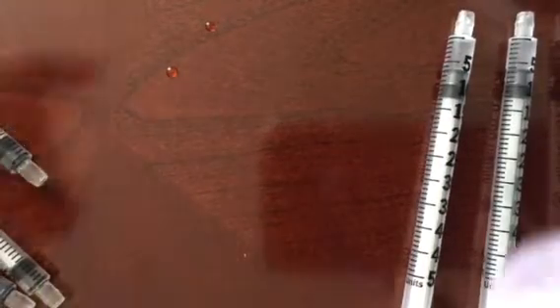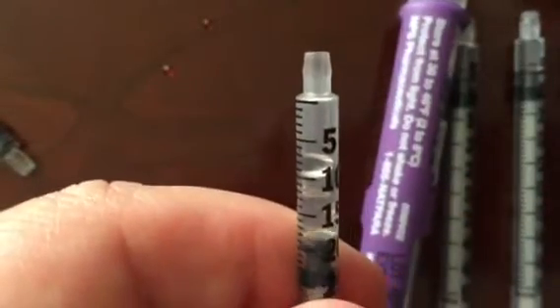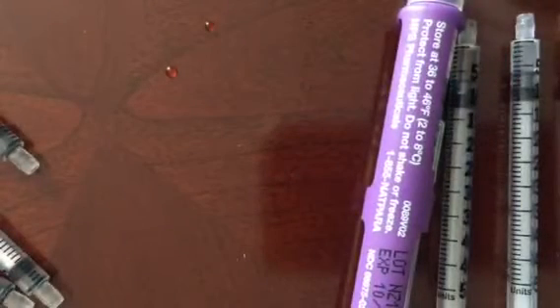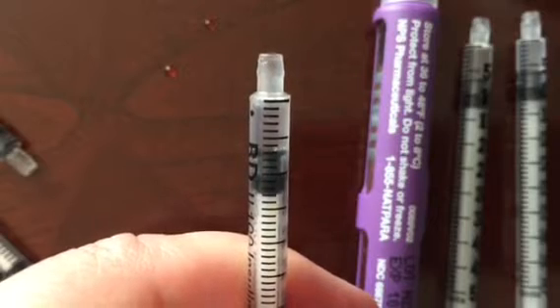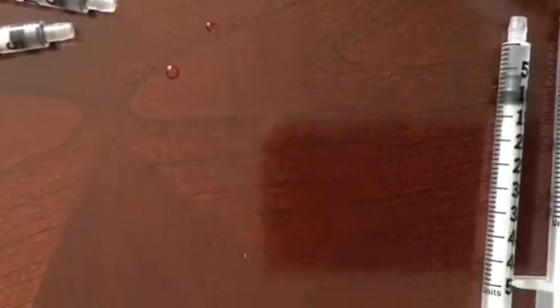All right, next day. Get all the air out. Big air bubble at the bottom. That can be accurate. There we go. Turn it so you can see the markings. Right on up to the top. And 6.5. All right.